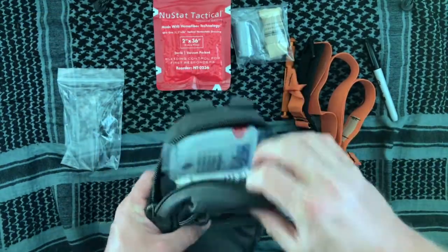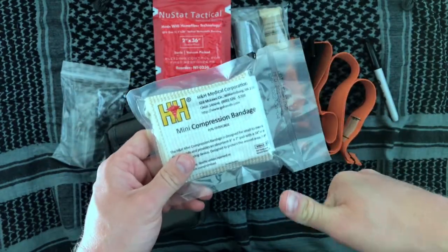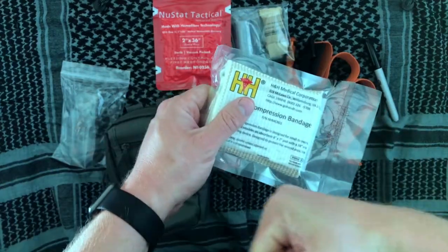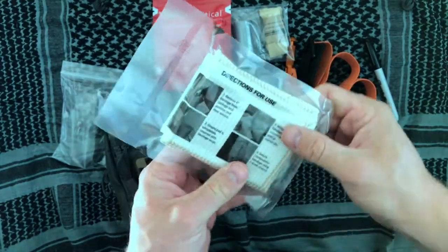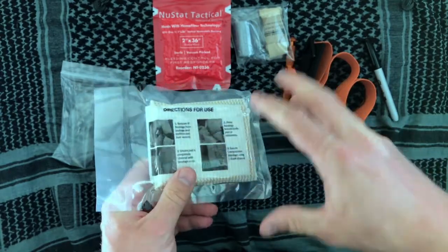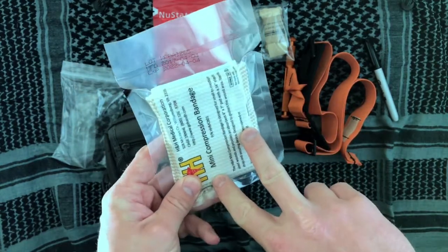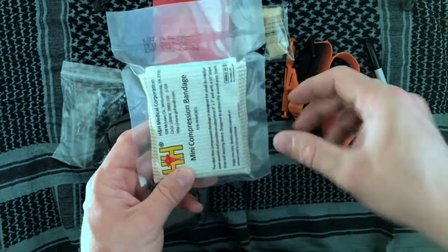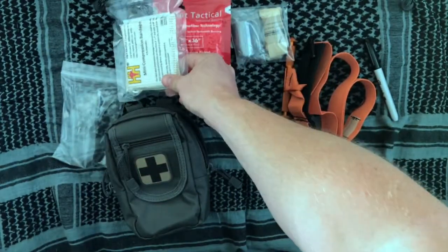That ties into the next item: a compression bandage. Once you've got the hemostatic gauze packed in, you take the compression bandage and wrap it up. For example, if you were shot in the arm, you wrap it up and the compression bandage keeps sustained pressure on that wound — more than just gauze and tape, it's specifically applying pressure to the wound area. In some of OTEC's larger packs you'd see the Israeli bandage style, but this one is flatter and fits the smaller package better while still functioning as a compression bandage.